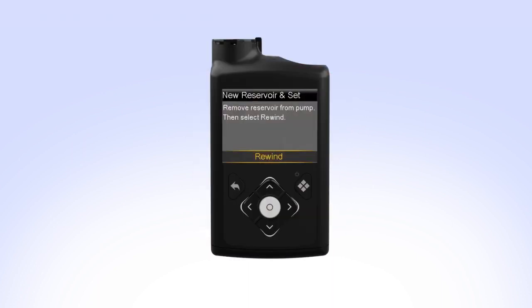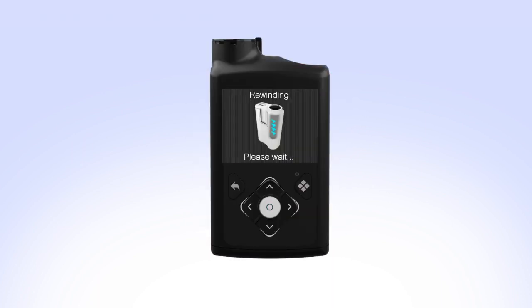On your pump, select Rewind. The rewinding screen will appear while the piston rewinds. Rewind complete appears when the piston has rewound. You can now set the pump down and prepare to fill the reservoir.